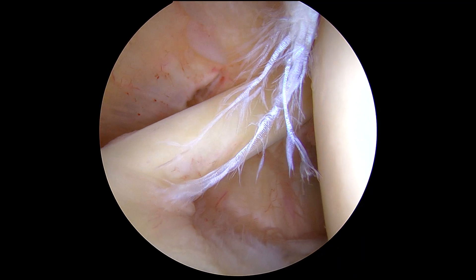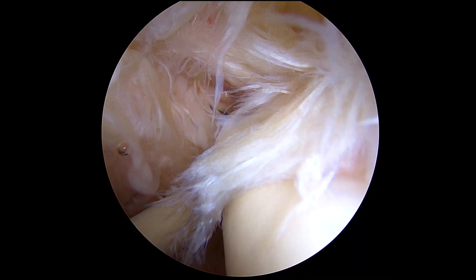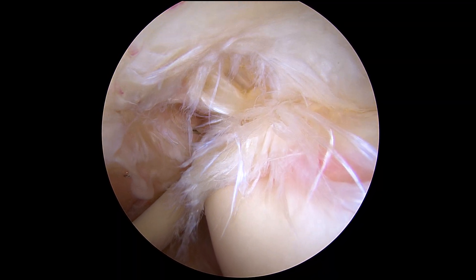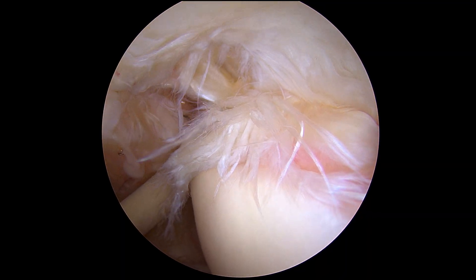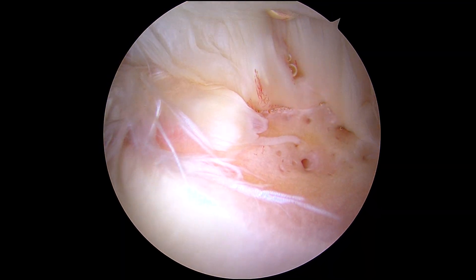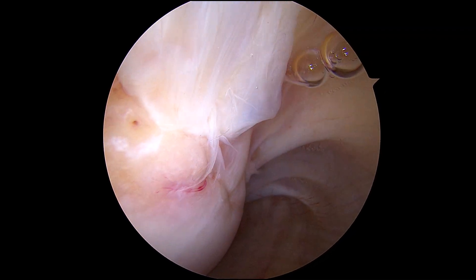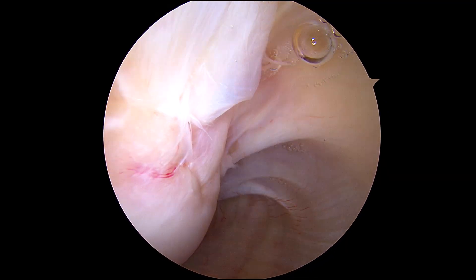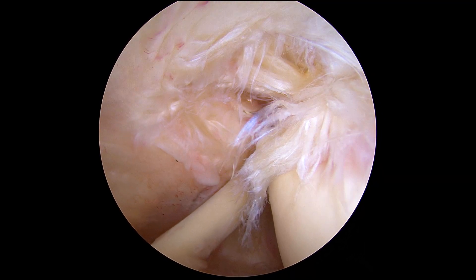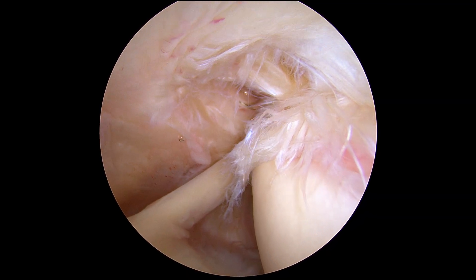The last thing we want to look at is the rotator cuff. If we project our eyes upwards and then extend — that is not normal rotator cuff tissue. This looks like a high-grade articular-sided tear of the supraspinatus. If we angle a little bit posteriorly you can see the infraspinatus, and then teres minor more towards the back. There's no full-thickness tear that we can see from the articular side, so that's a partial-thickness articular-sided tear of the rotator cuff.